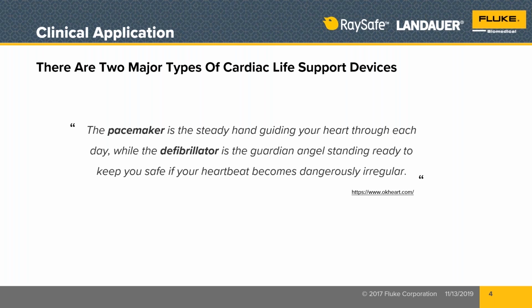The reason the pacemaker is designed to not try and pace asystole or flatline is it needs to alarm and call out asystole or flatline because either the patient is dead or we need to do something else besides pacing in order to get the heart to start beating again.